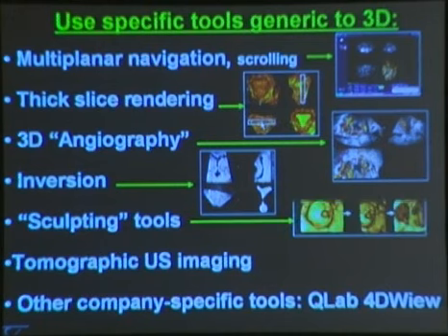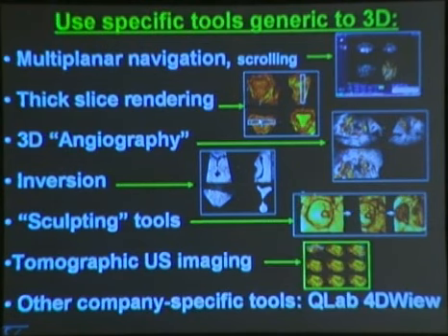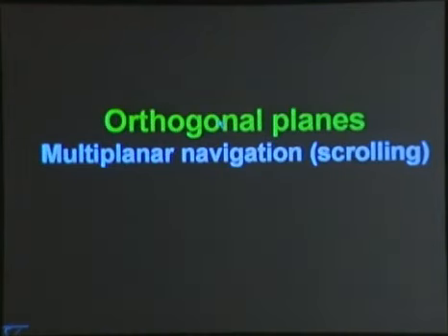We have several sculpting tools available which may become important in GYN 3D. Tomographic ultrasound imaging, which once again will turn around probably the field even in the gynecologic applications, and other company-owned laptop or station or softwares that are used. So let's get into particulars.